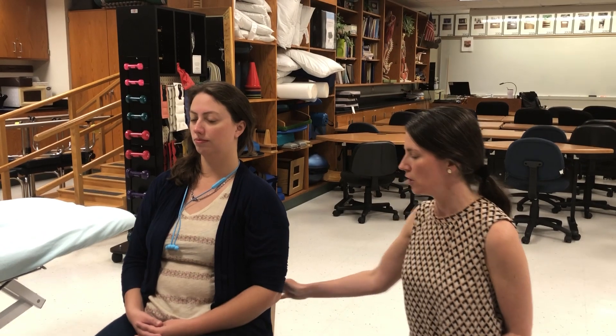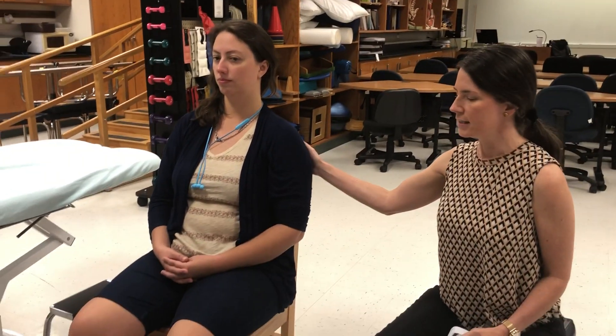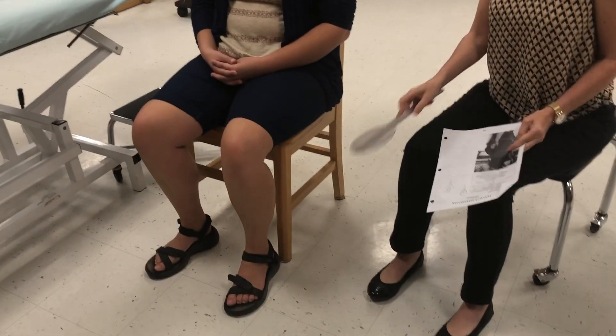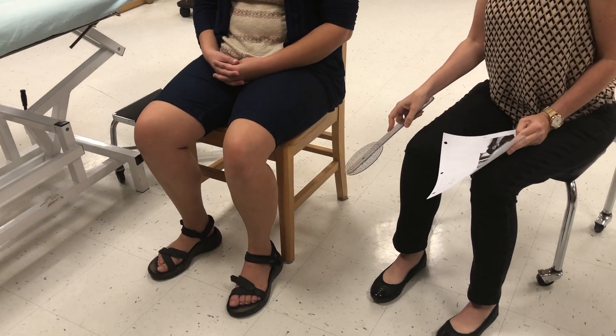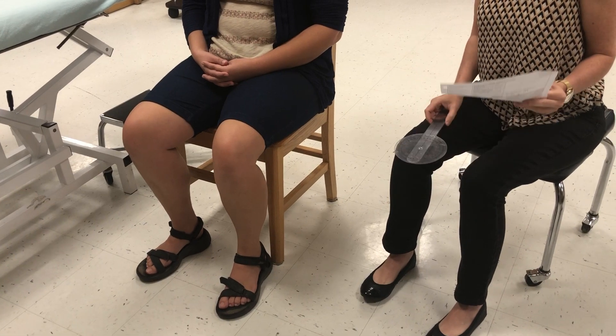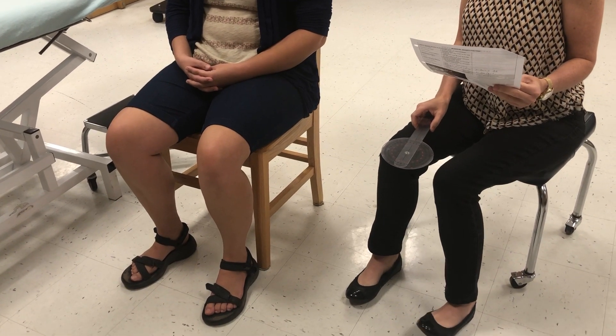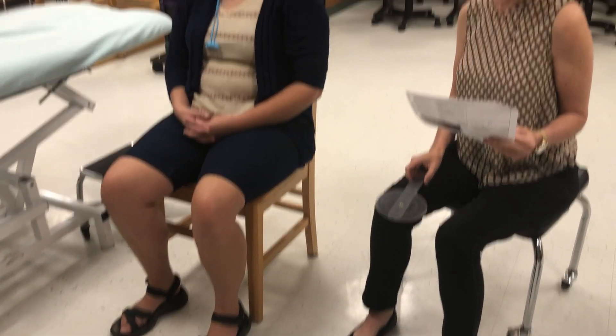The patient position is the same as flexion and extension: the patient is sitting in a wooden chair, back is supported, feet are supported. If the feet were not supported, we would put a couple of foam squares under there to make sure that they are supported.